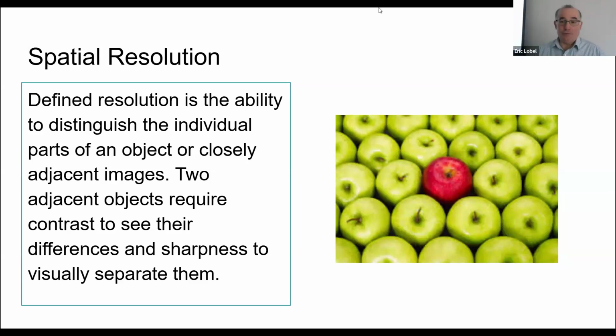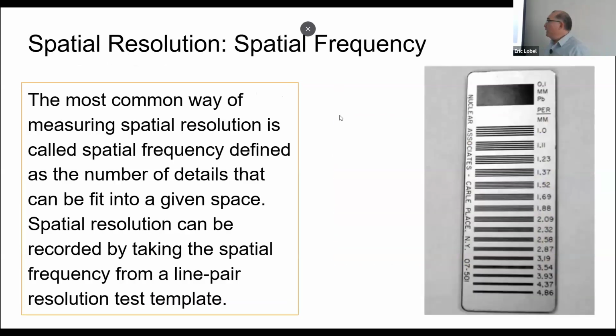that's spatial resolution. And we said we can measure it in line pairs. We've done this in the lab multiple times. Our tool is nice and square and little, right? And it's kind of hard to sometimes see where the lines blur together, but where they blur, I know you guys have to come to a consensus because everyone sees things a little bit differently sometimes. But the consensus ends up being that where it blurs is where you've lost your spatial resolution.